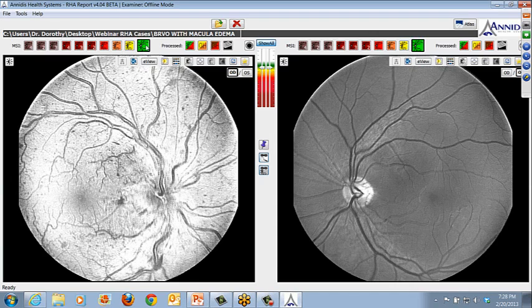So now, of course, he came back to me for an intraocular pressure check, and I had just put the instrument in my office, and I wanted to get some optic nerve baseline images with the MSI. I had already had some other optic nerve images, and much to my surprise, he was not complaining, had not noticed any vision change in his right eye, and he had stopped taking his eye pressure medication because he thought that they were irritating his eyes, and he didn't call me to tell me that, and this is what he comes in with.